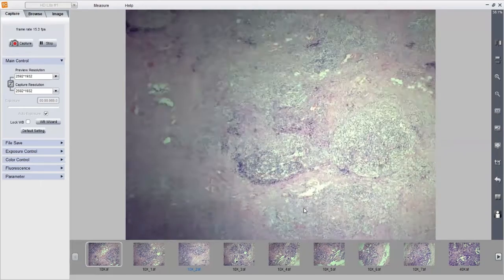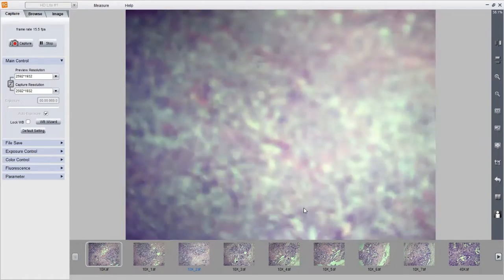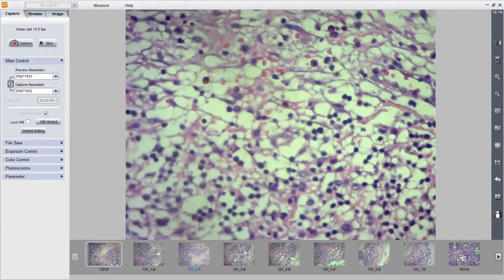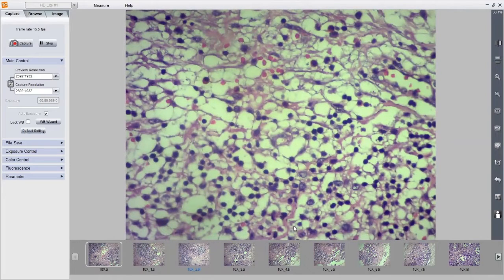And again, if we look, I'll show you one area where we are going to see the abnormal cells. This was a place where the Hodgkin cells are not very clear, but there are these kind of atypical looking hyperchromatic cells. Yeah, the mummified looking cells. Remember I had shown you some mummified cells. Yes, these are the mummified looking cells. The background is very reactive, with very nice small lymphoid cells, some histiocytes, and some eosinophils maybe.